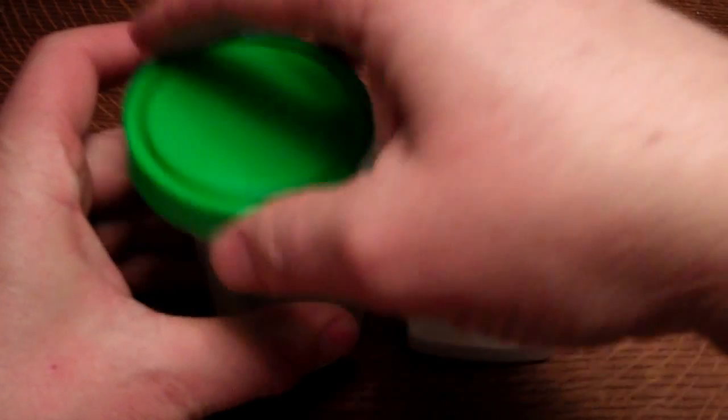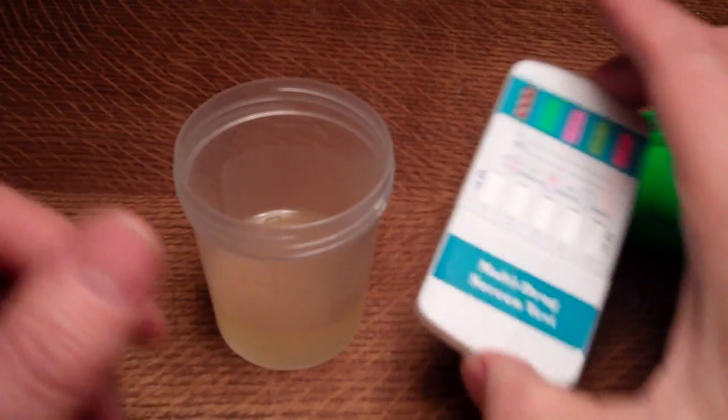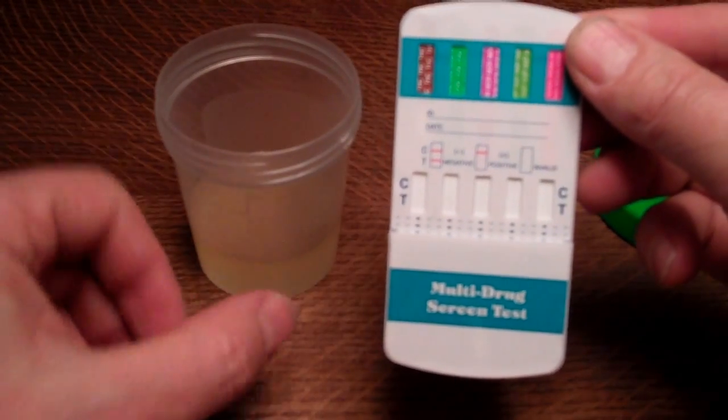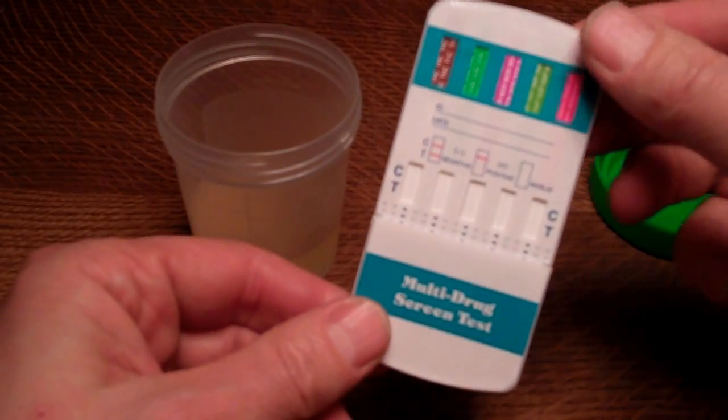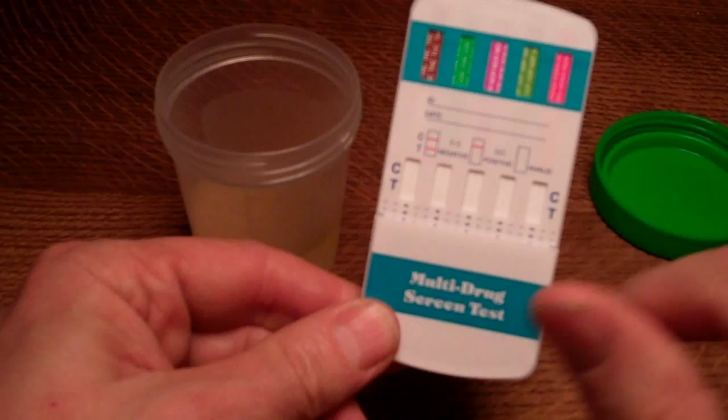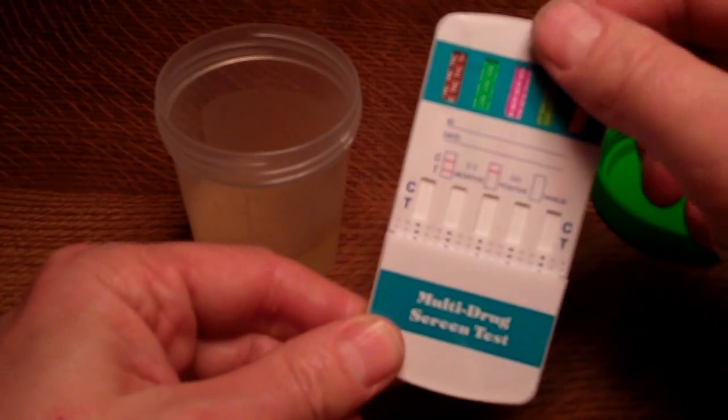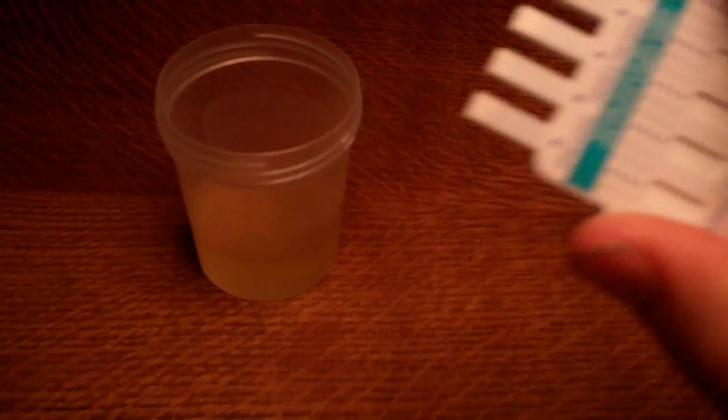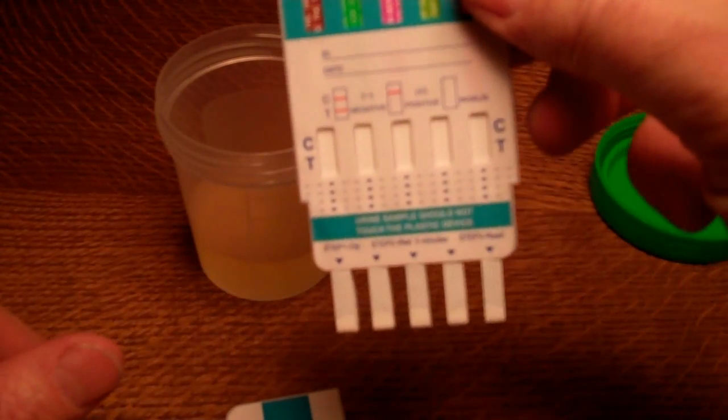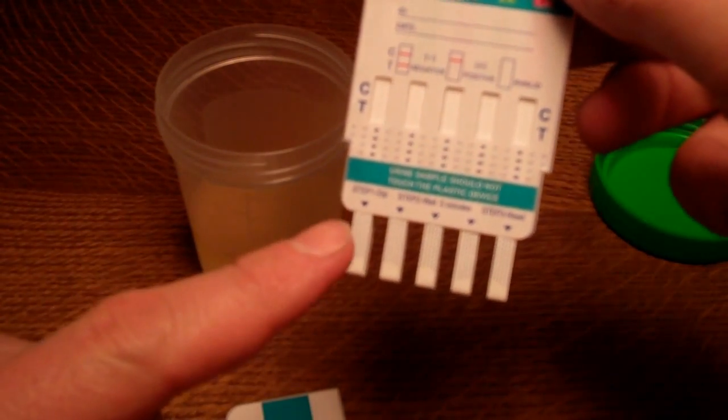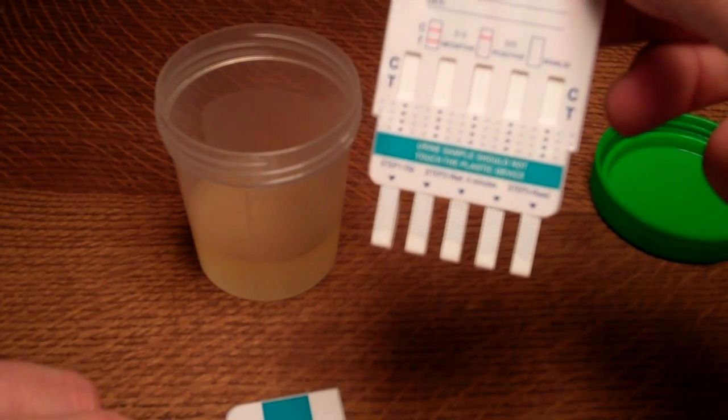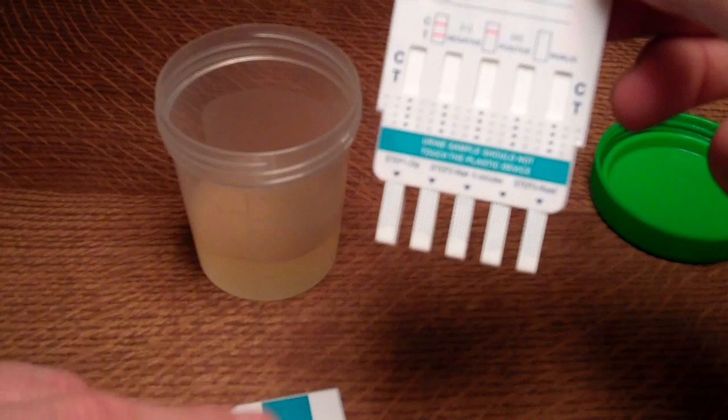So we're going to show you the procedure for running one of these tests. We've got a sample of urine here which we're going to use. The drug panel is a flat panel device with, in this case, five test membranes loaded into it and a cover which separates from the drug panel, revealing the prongs which are the dip prongs that go into the urine sample.